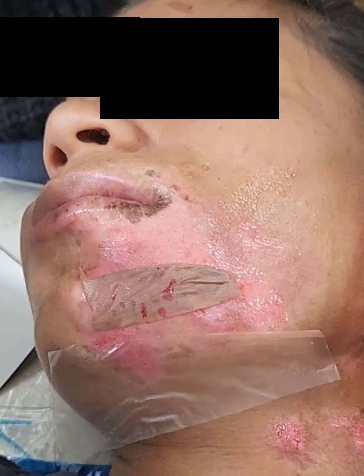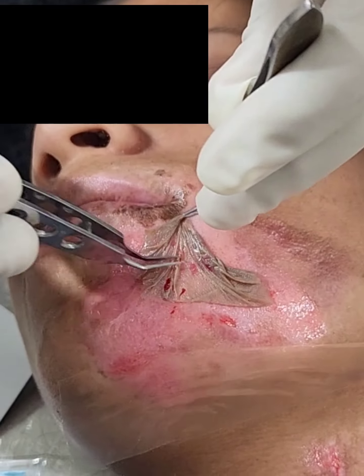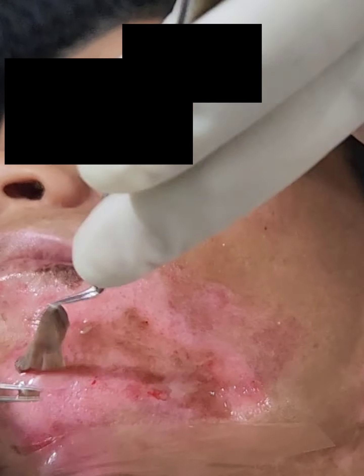The trypsin was neutralized. Now, instead of the conventional melanocyte cell suspension technique, this is the discarded dermis. The cells are directly transplanted onto the dermabraded recipient area.